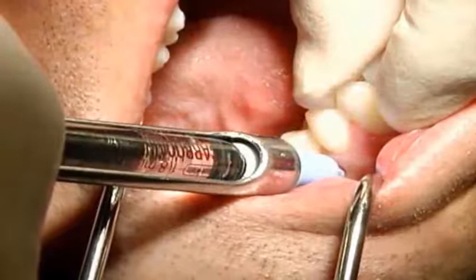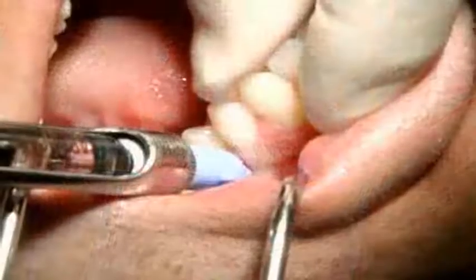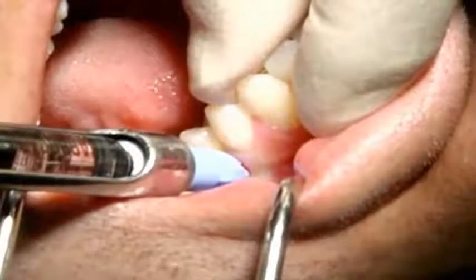Approximately a half cartridge is injected under some back pressure. Note the blanching of the mucosa.